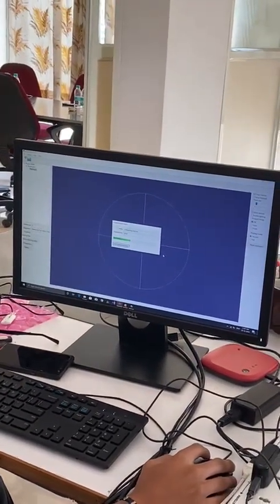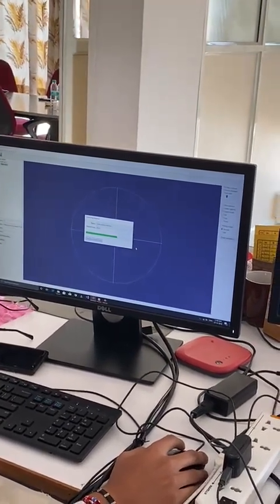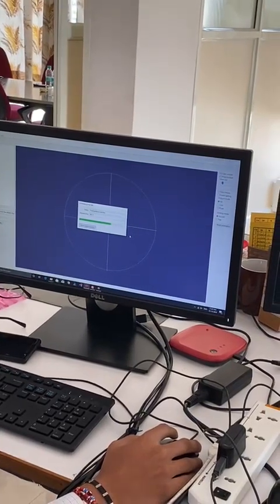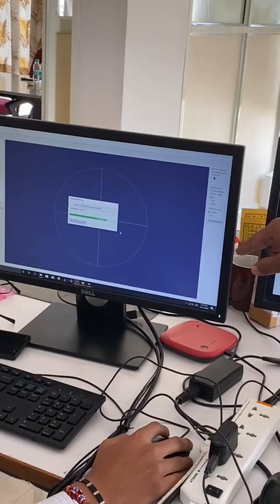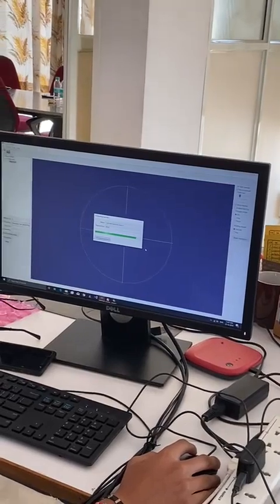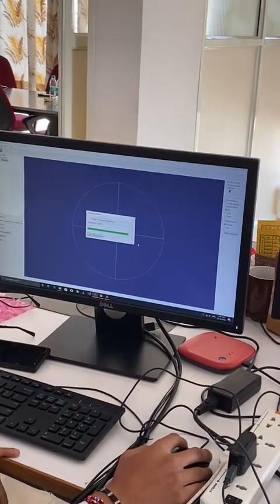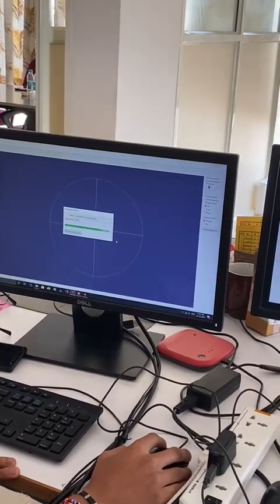No, my point was, if it is a default 0.7, then it will vary every time? No, it will not vary. This is specific to this camera. Once that camera comes into the picture, it will have its own specification. Then camera to camera you have to calibrate? Yes, we will have to calibrate. It will take around 1 or 2 days for us to calibrate the ratio for that particular camera, set it, and based on that setting, we are going to automate the entire process. 0.7, 0.6, that will be in our scripting.